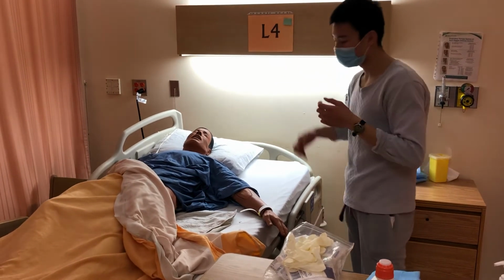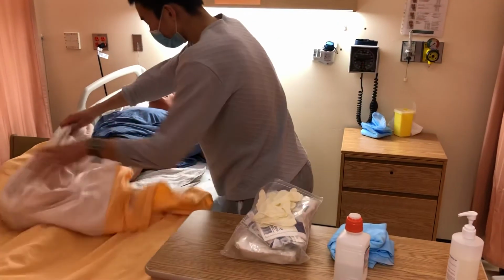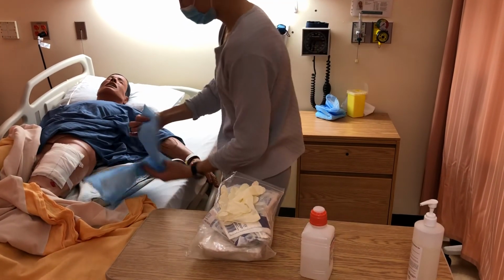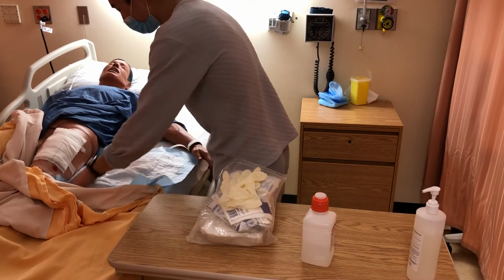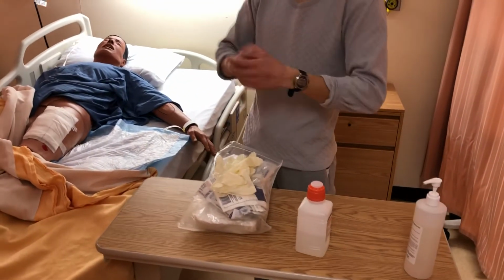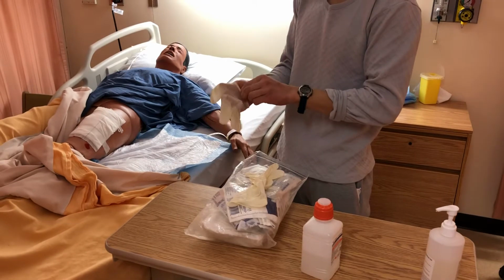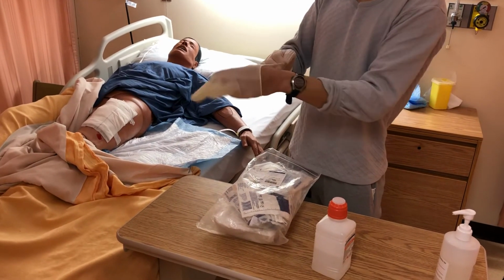So I raised the bed up to my working height, and now I'm going to wash my hands, expose the wound area, as well as put on my absorbent pad. So I have an absorbent pad right here, which I'm going to tuck under to absorb the irrigation splashes. And now I'm going to wash my hands and don a pair of clean gloves. So I don my clean gloves.